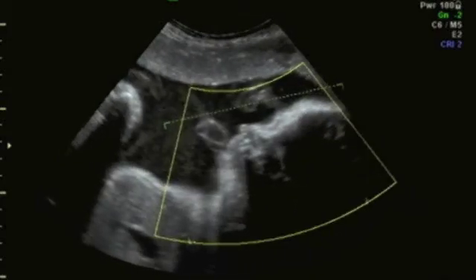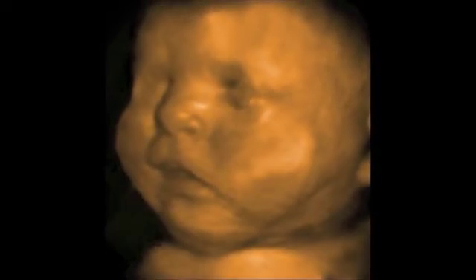Recent technology now allows us to capture an image unlike anything before. With groundbreaking 3D technology, we can now produce a realistic first look of your little wonder. It is one of the biggest things that have come along to pregnant families and has gone on to become the number one way families bond with their unborn baby.